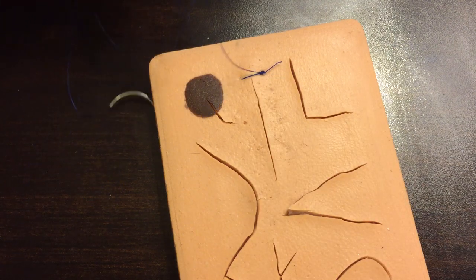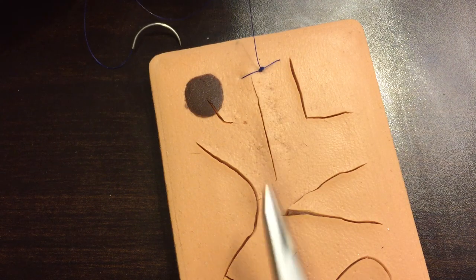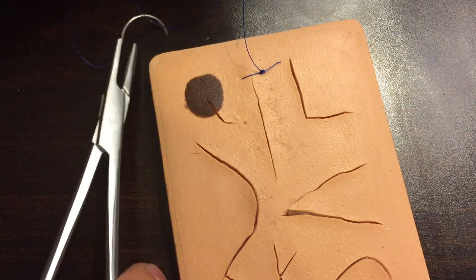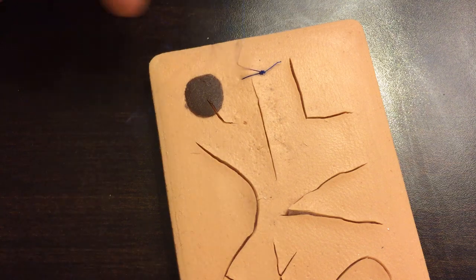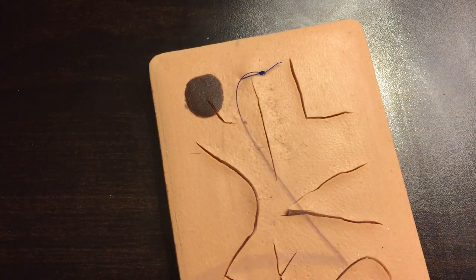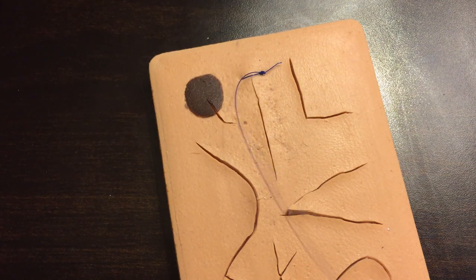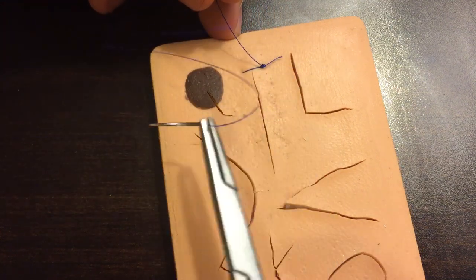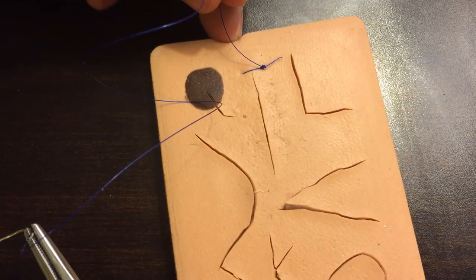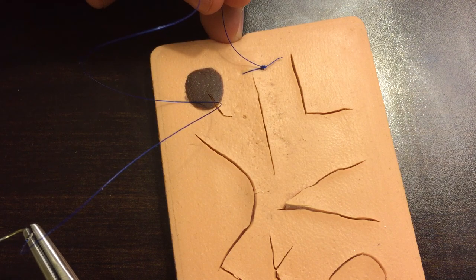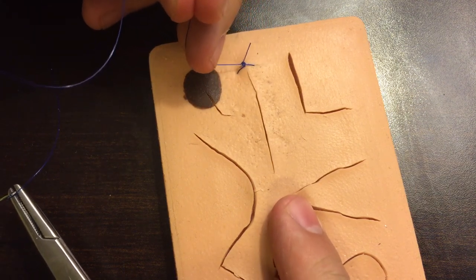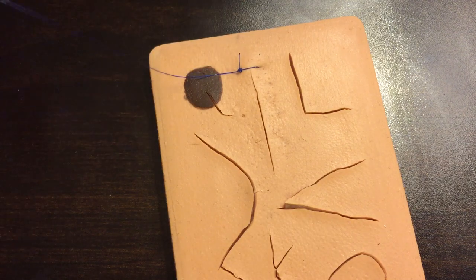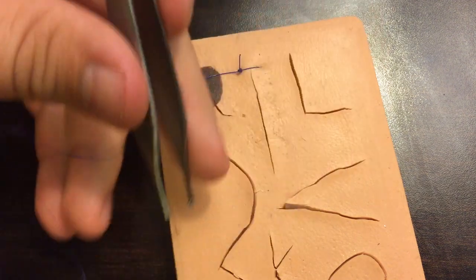So now notice the difference here that with a simple interrupted, I would have cut both of those and then started a new suture altogether. But for a running suture, a running locking suture like I'm going to show you now, we're going to leave this end intact so that we can continue on. But normally my knots will end up over on the right side because I'm right-handed and most people doing a simple interrupted will throw it onto the right. But for this, I'm going to pull my knot actually over onto this left side. And the reason for that will become apparent here in just a second.